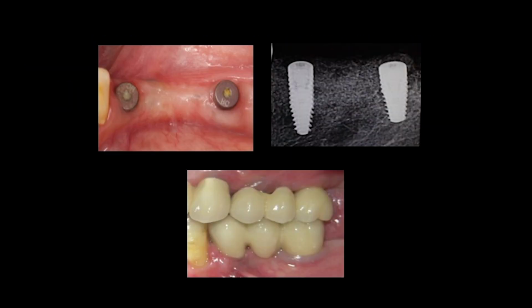Okay. This is the healing after 4 months, excellent soft tissue and bone graft healing. We put 2 implants at areas 4.4 and 4.6, and these are the 2 implants, and this is the ridge after augmentation.